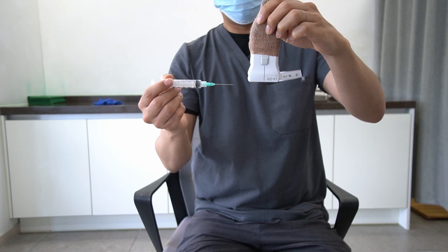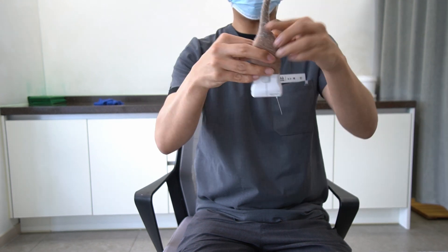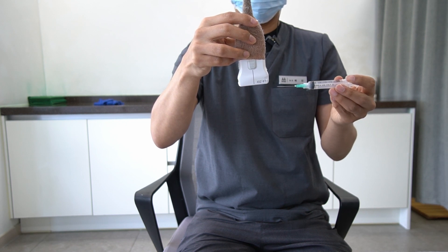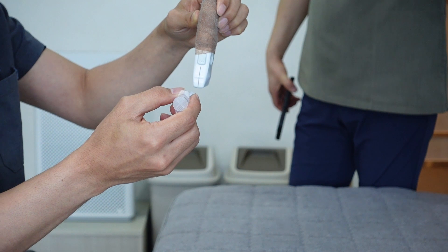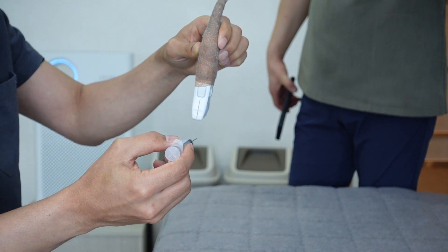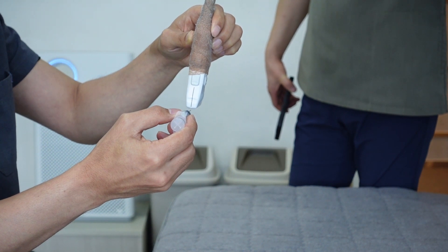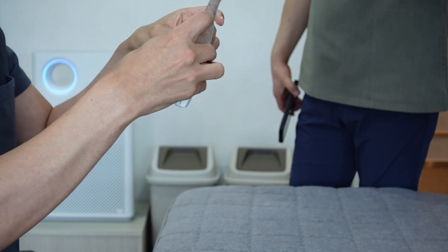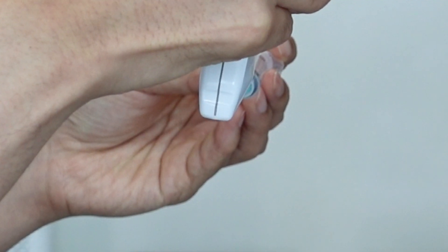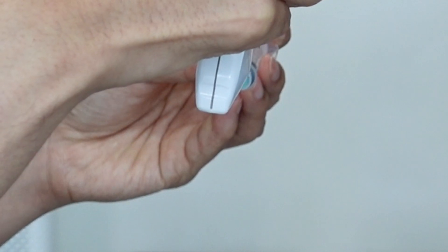Here is our second volunteer. Similarly, he will move the needle horizontally from the right to the left side. Afterward, he'll switch the needle and probe between his hands and move from left to right. We've also closely examined the needle's movement in alignment with the ultrasound probe, capturing the motion from a right lateral point of view. He handles the needle control quite well, keeping it centered. However, as the needle crosses the ultrasound probe, it tends to shift towards the operator's side, causing it to be off-center.